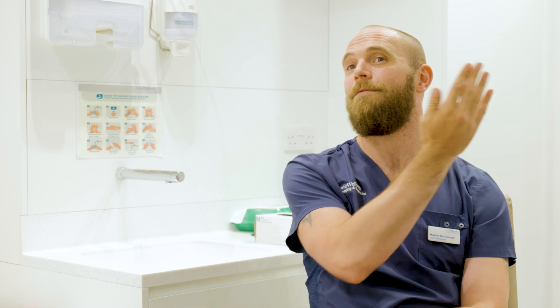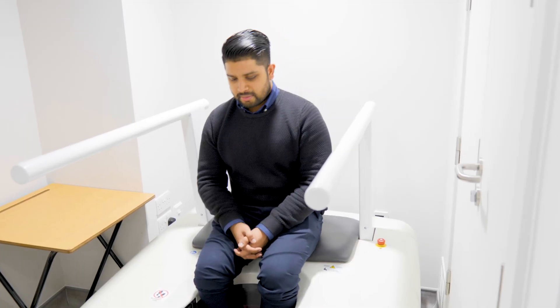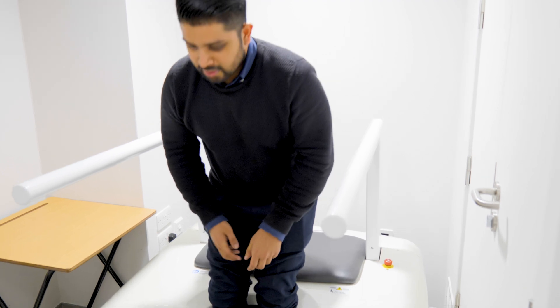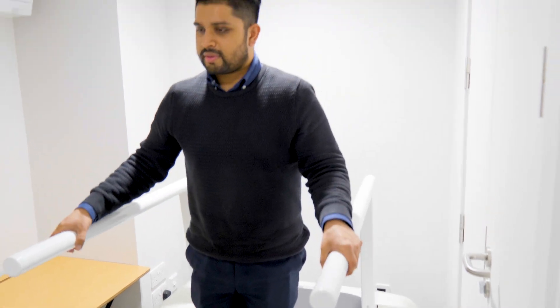It's a standardised dose — a little bit like when you go to the dentist and have a picture where the machine revolves around your head. It's the same principle, so it's a much lower dose and very quick. It's also very accessible for patients: if patients can't fully weight-bear, they're able to sit down on the scanner and apply as much pressure as they can through the area being scanned.